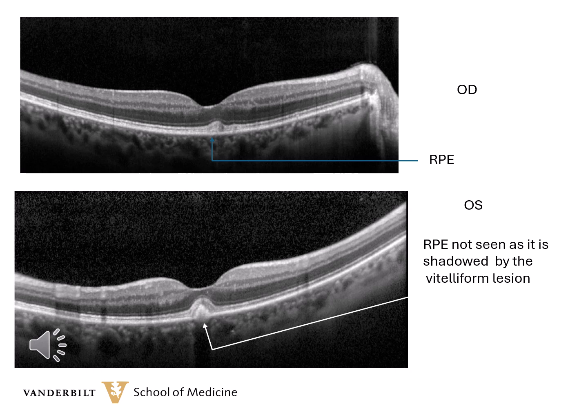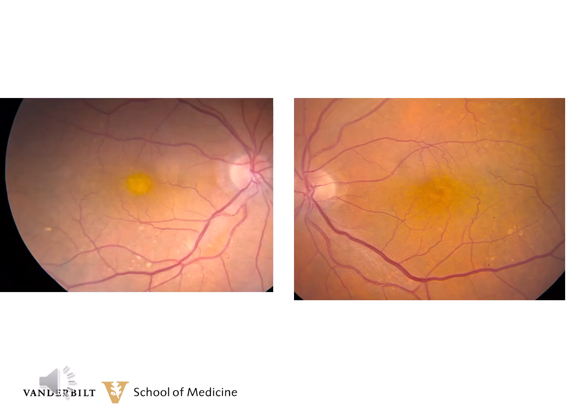Here's a more magnified view of that patient's OCT. Again, it shows the solid lesion above the RPE. The left eye shows shadowing of the choroid under the vitelliform lesion. These lesions need to be distinguished from drusen and drusenoid detachments, and we'll show some of that later. Again, even though it is genetic and it is a dystrophy, the presentations many times can be asymmetric, which can get you confused if it's only in one eye.